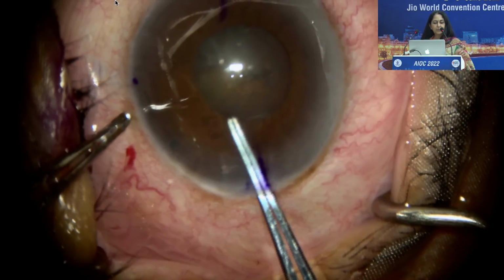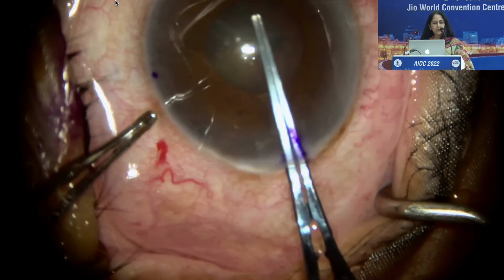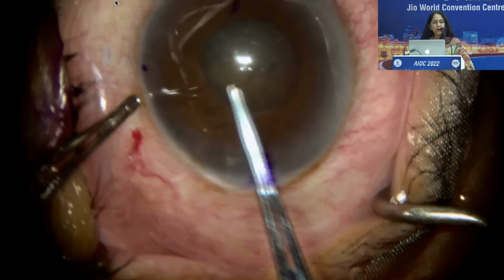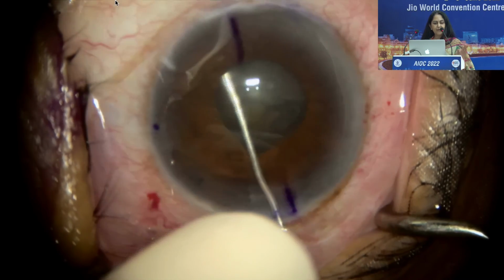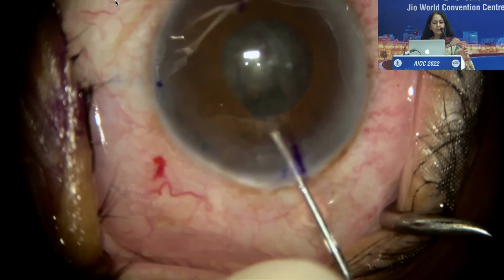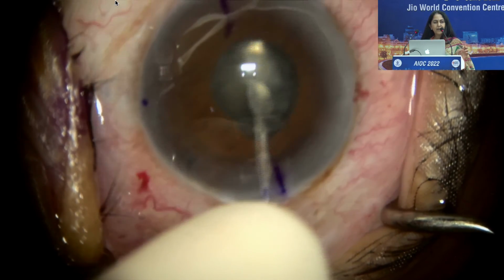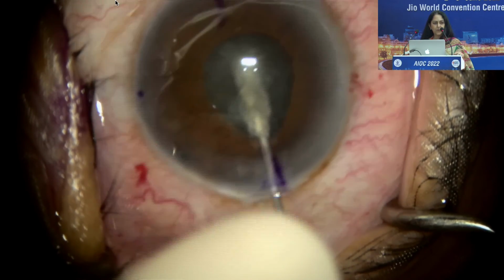Once you have marked the axis preoperatively, you need to again stay at the center and get the rhexis done beyond the pupillary margin. The important part here is to hold the rhexis at the margin at the end which you have left as a flap. Hold, and you pull it out. Here again, we are doing a very gentle hydrodissection. It's a sticky kind of nuclear material, so a very gentle putting of the fluid and nudging of the nucleus is done.